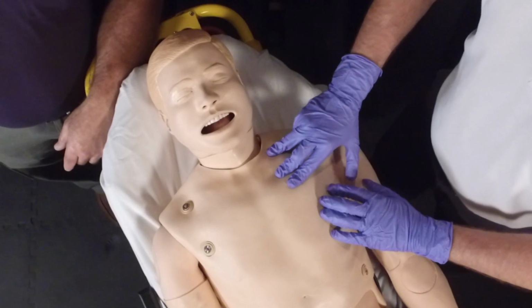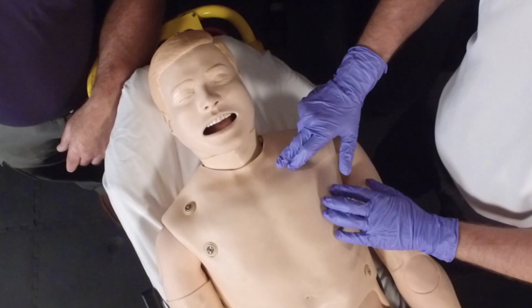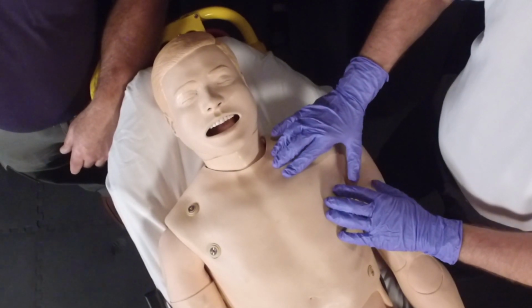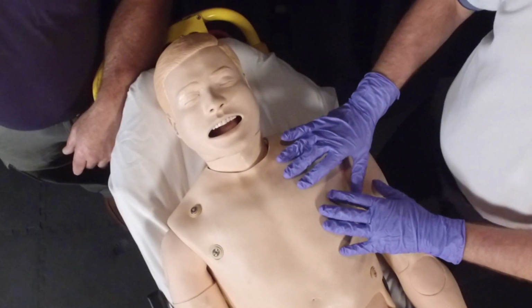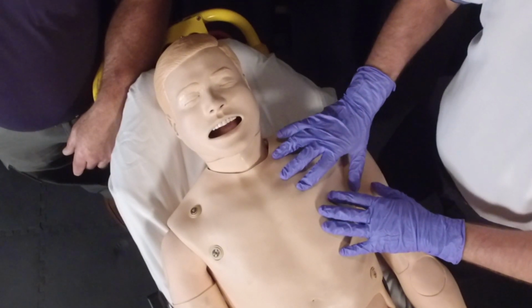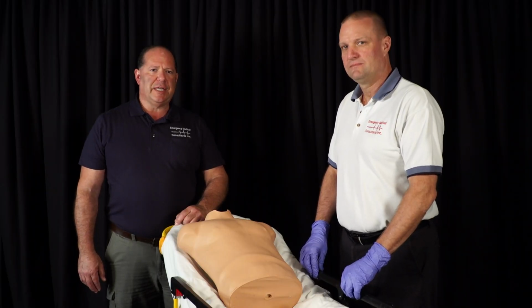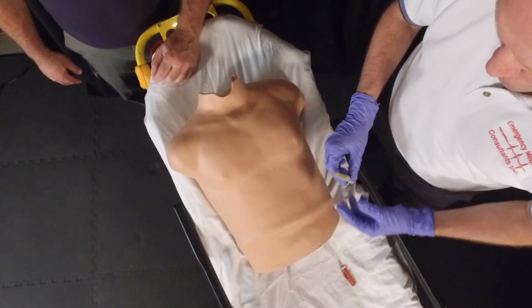So the second rib you see will be where the proper space is, and then the third rib will be the optional space. It's going to be just about midway between the nipple line and clavicle.